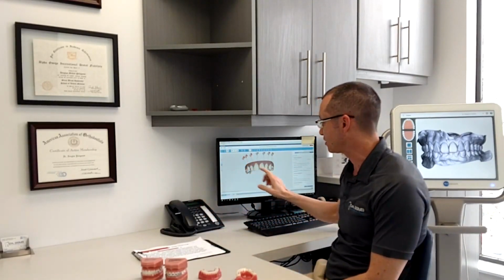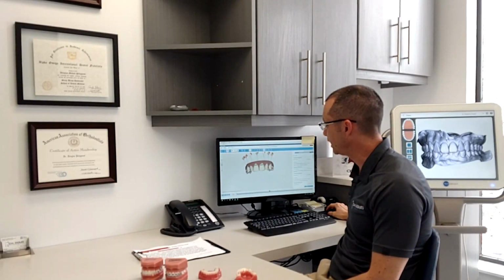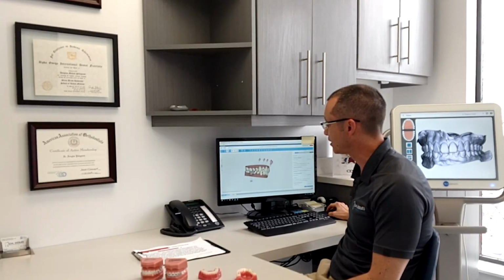So once we take these records, we upload them to Invisalign with detailed instructions through their website on what we want to achieve. Their lab techs will then take our instructions and our records and send us back what we call a ClinCheck, which is basically a 3D simulation of the whole treatment process, from what each aligner does till the end. And we can actually click through on the sample you see behind me, and it will play like a little movie, from every angle we can view it on what actually is going to change during the treatment, what each tray does.